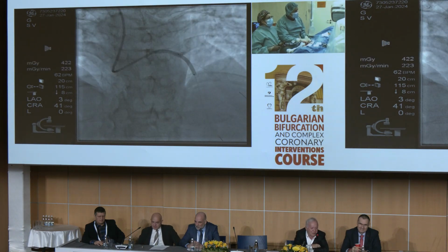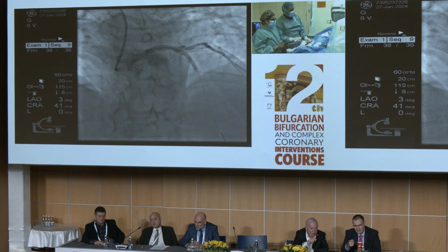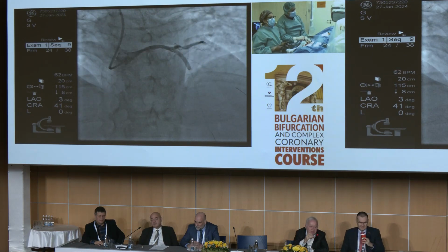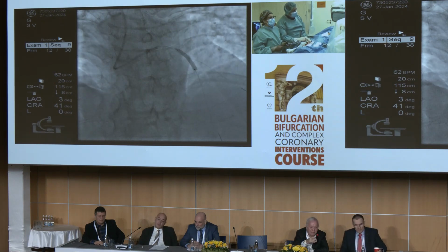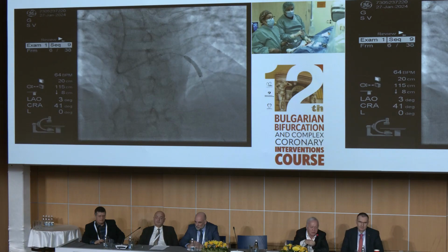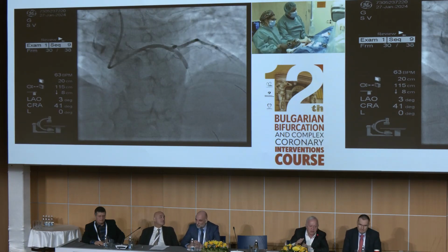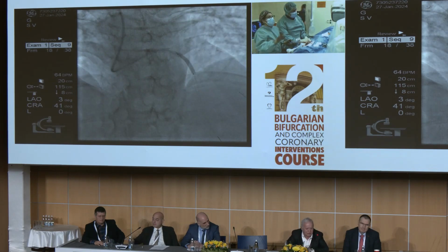So 30 seconds. You can see that the proximal part is not fully deployed at 12. This is the rule I am explaining here, normally after preparation, because here we will probably have to use a higher pressure. We'll see during the second inflation. Now you can deflate, we can discuss for 1 minute, and you can reinflate again for 30 seconds without moving.